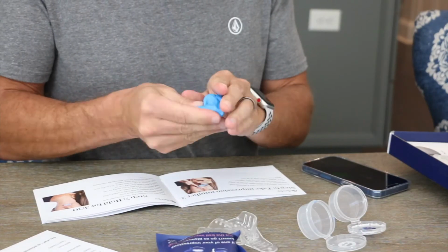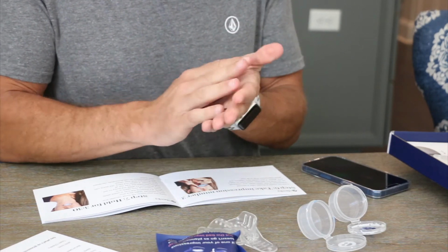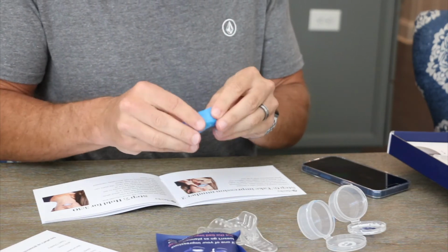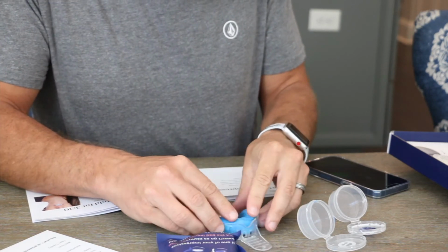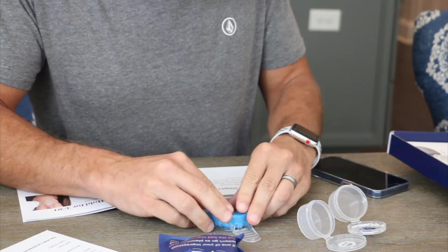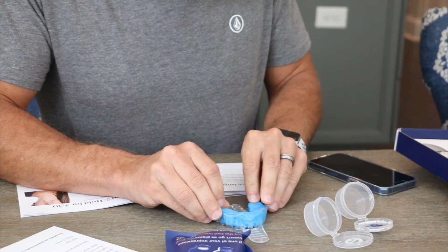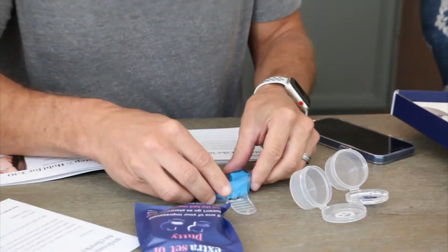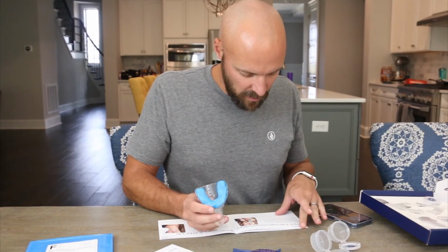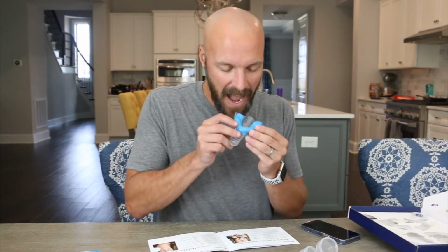Okay, so we're almost back to where it's all blue. Once you do this, you're supposed to basically form it into a snake, if you will, and put it into your tray, right? So you have the whole tray covered. You want to make sure your whole tray is covered. You've got to move quickly here, and then you put it in evenly into your mouth. Then you have to start a timer for 3 minutes and 30 seconds and leave it in. So I'm going to do that and obviously now talk through it.